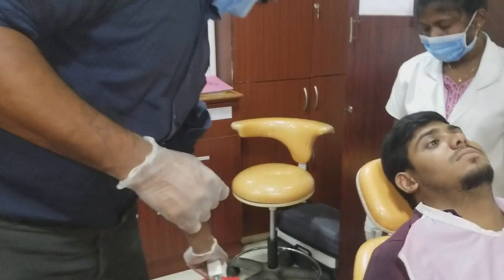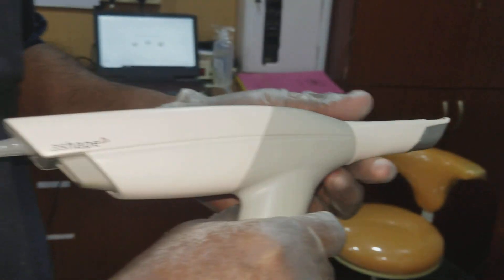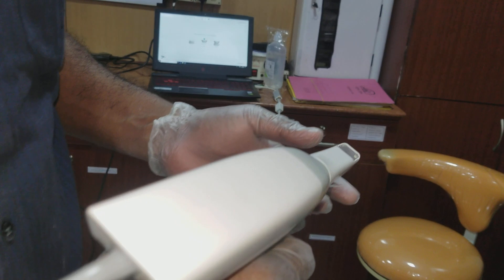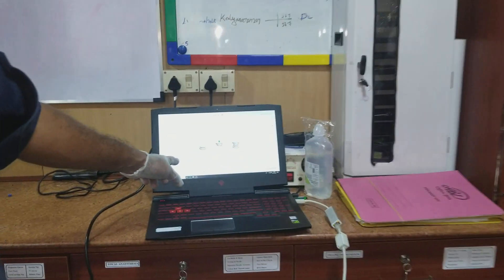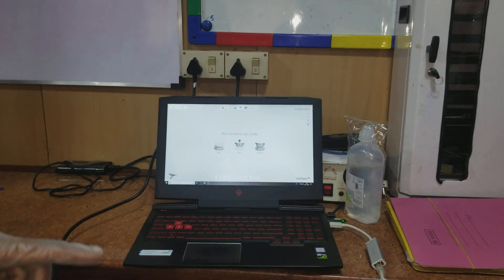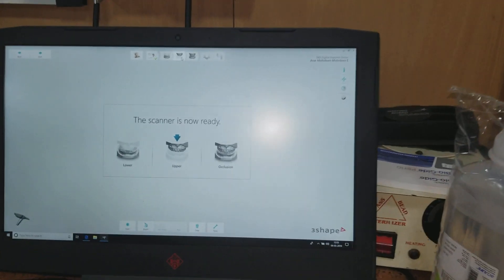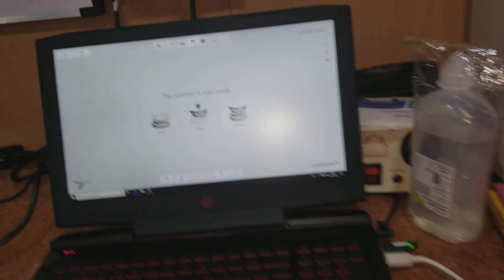This is called an intraoral scanning device from the company called 3Shape. It works on the philosophy of very high digital photographs combined and stitched together with the help of special software. When I am going to scan the jaw, you can see the impression will be coming up here as I do it.